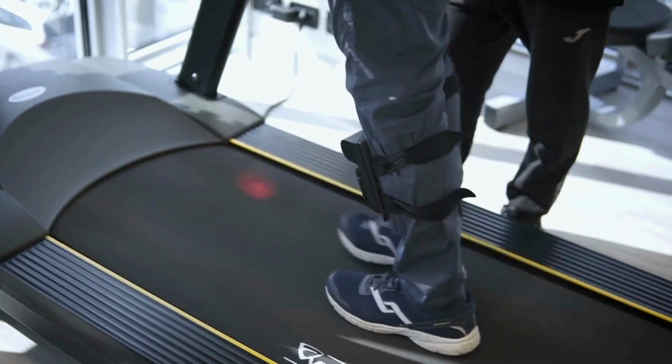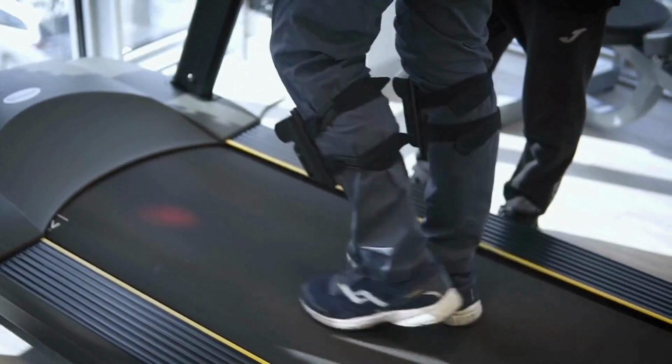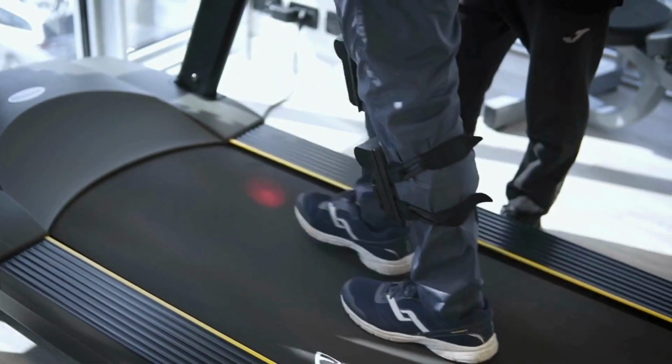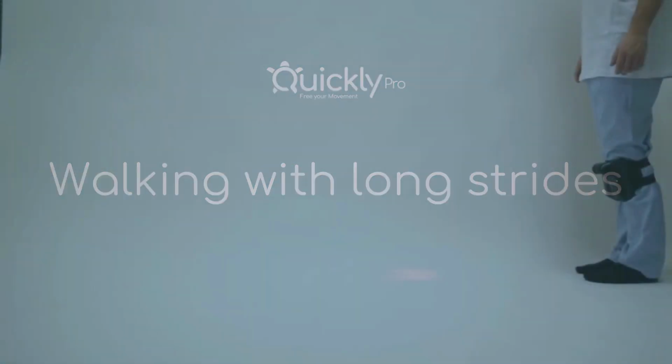Walking on a treadmill. The exercise involves walking on a treadmill with the use of visual feedback. This training can be very useful in the phases of walking training on a treadmill. Visual feedback guides the foot's point of support.